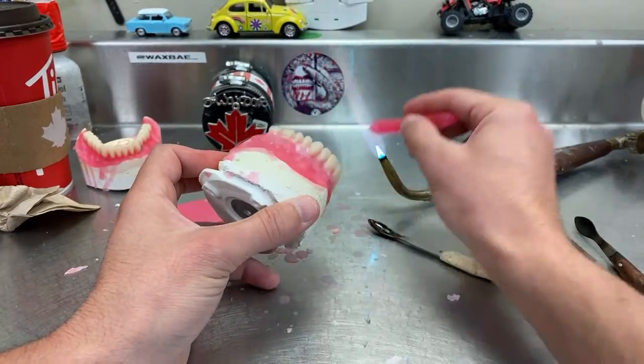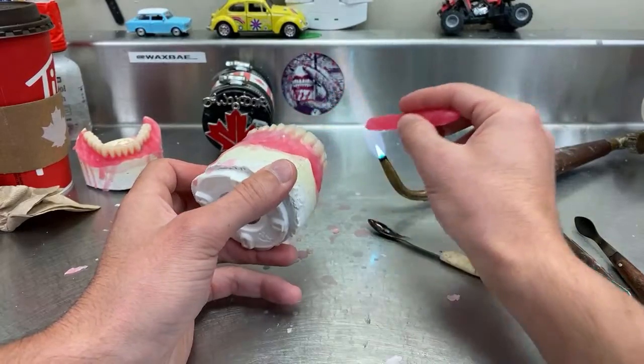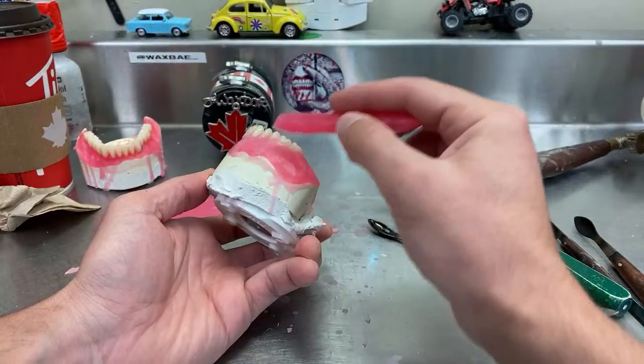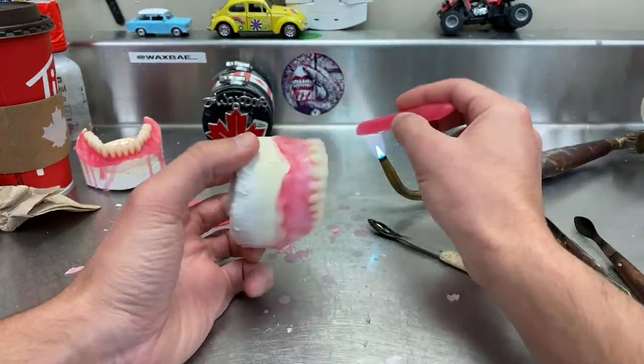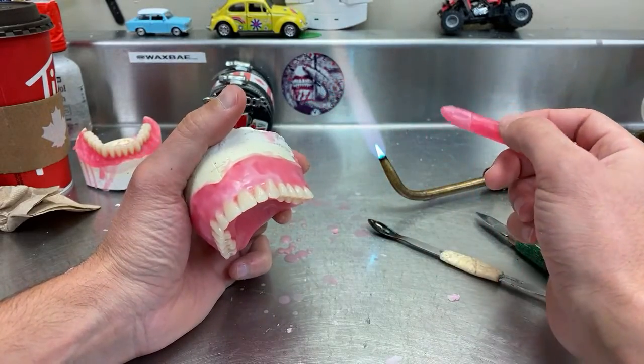And just make it random. Don't be so precise about how you want it to shape, because that's what gives it that natural look. If you make everything unified, everything perfectly done, it will actually look like a denture. It will look like a man-made.